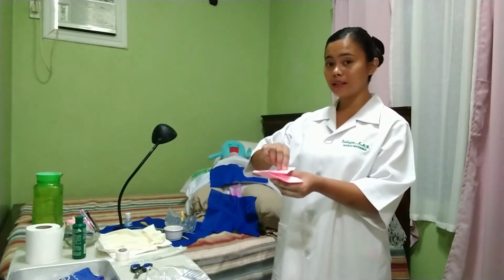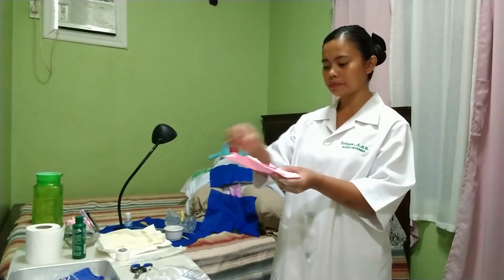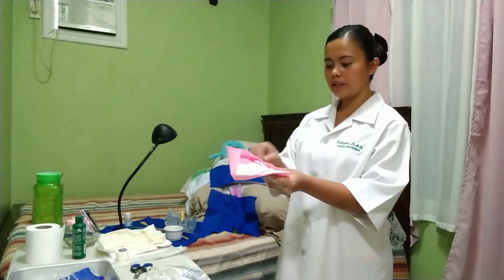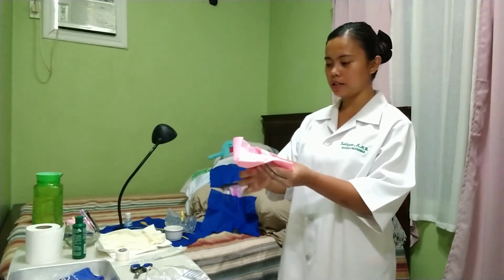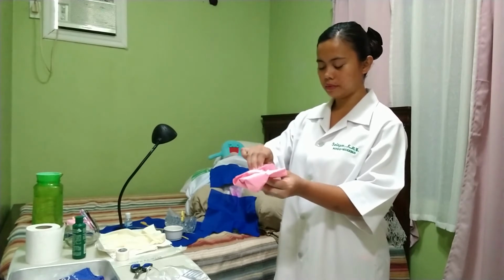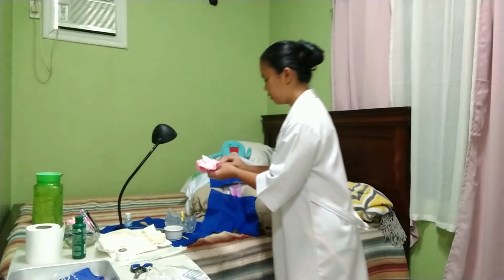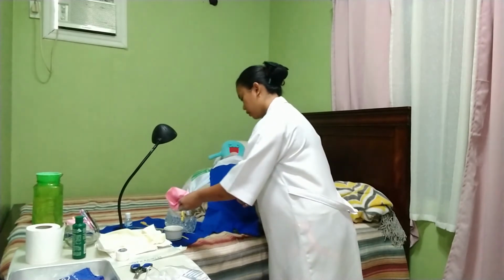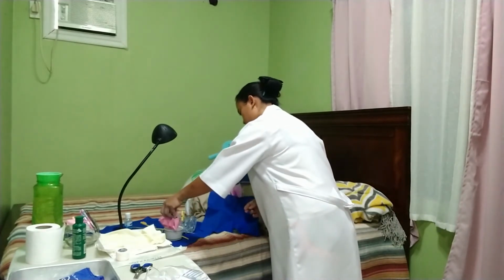Starting from the point away from you, and tuck it under. And do the same thing right here. Let the cotton fall.